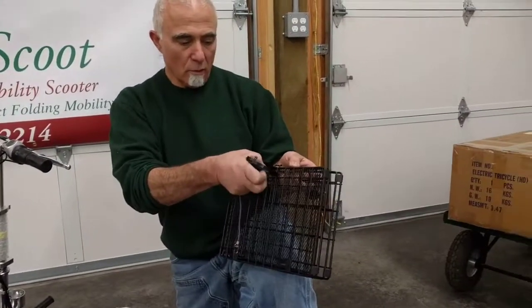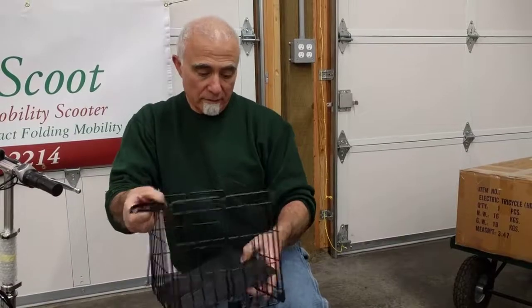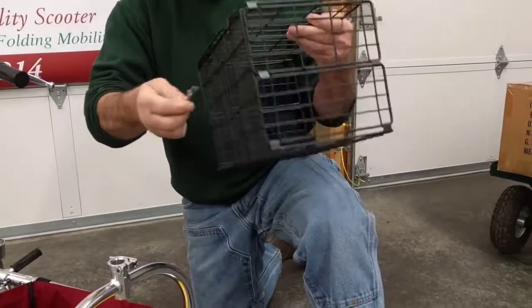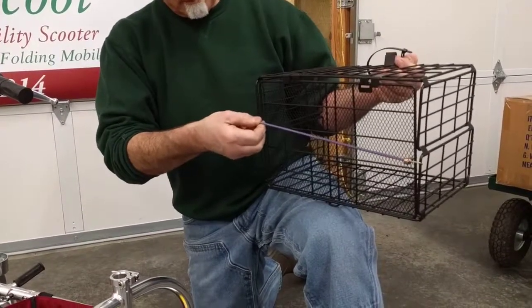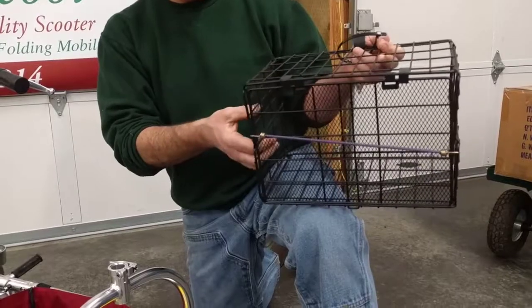This is how you'd receive the basket. Open it up, remove the bungee, lower the basket floor, and let's flop it down. Strap the bungee across the floor, the bottom of the basket. This helps to keep the sides from bulging out.